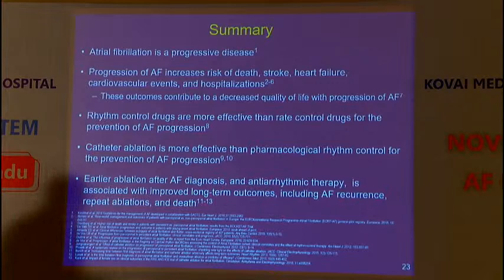To put a little more perspective, we do a lot of ablations as electrophysiologists. We do AV nodal re-entry ablations, we do accessory pathways. We know these are all very successful ablations. I always tell my patient when they come for an AV nodal re-entry ablation, if he comes back again to my OPD, I'm a little worried. I don't want to see him again because he's cured. He will never come back to my OPD.